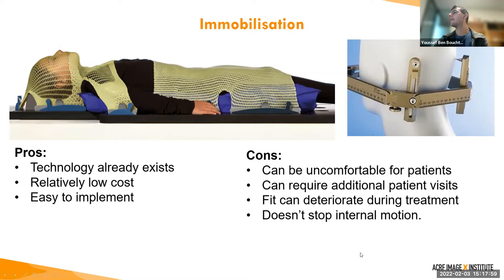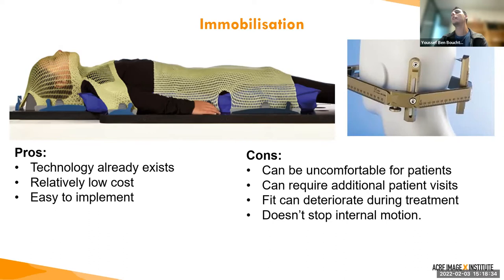Immobilization is great at stopping external patient motion, but it does nothing for internal motion — the patient is still breathing, still swallowing, may have some jitters. Sometimes the fit of the immobilization changes if the patient loses or gains weight during treatment, and because the device sits right on top of the patient, this motion can often be hidden. For that reason, immobilization is not always the preferred method, but sometimes it's just necessary.